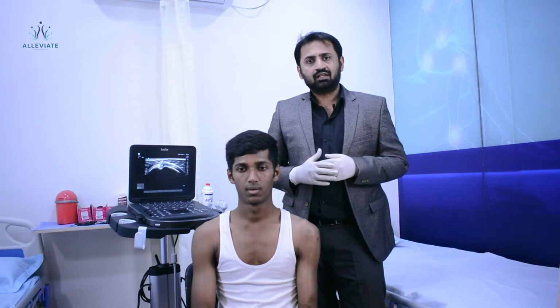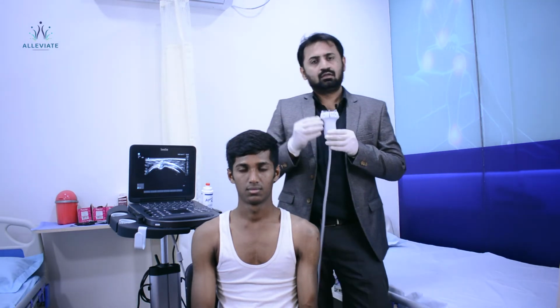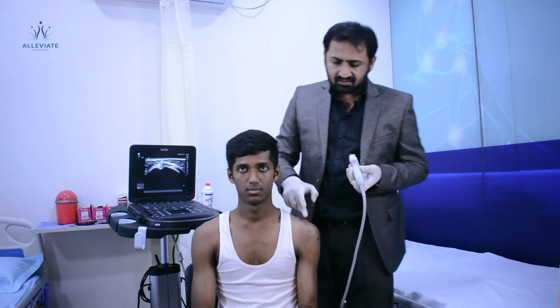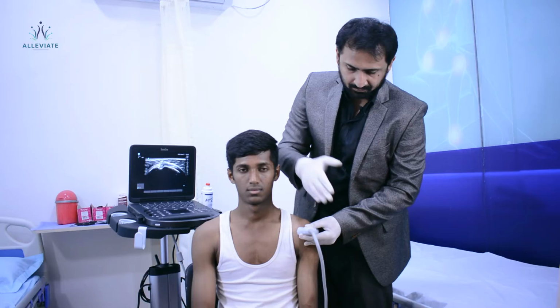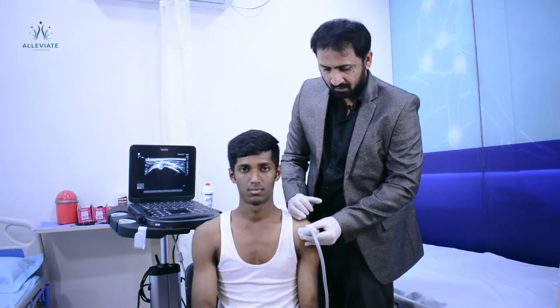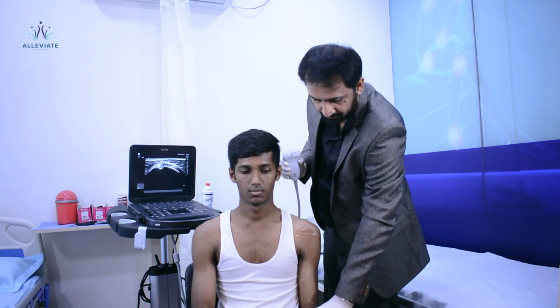Now I'll be demonstrating the sonoanatomy and the probe position. For the purpose, we'll be using a high frequency linear probe. First, we'll be seeing the biceps tendon. This will be the probe position and this will be the position of the hand. For the subscapularis tendon, we can move a little medial. Next, we will be seeing the rotator cuff.